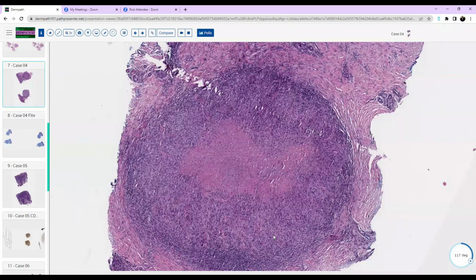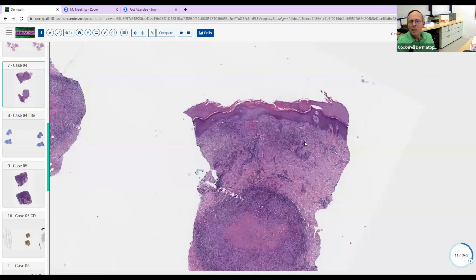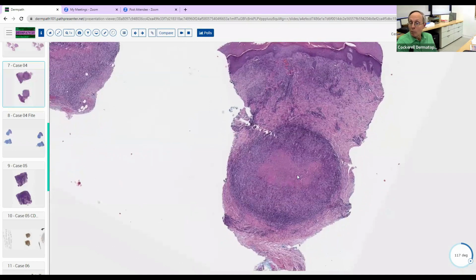Yeah, those are more of the foreign body granulomas, but there is acne, granulomatous rosacea can give you tuberculoid granulomatous inflammation. That's in the acne spectrum. So that actually can give you this, usually not this deep, large granulomatous inflammation like this, usually little smaller areas, but you'll see little granulomatous inflammation up here around follicles. And the differential diagnosis of granulomatous rosacea is sarcoid clinically, but if you see the caseation degeneration in the small tuberculoid granulomas, you should think that it may be granulomatous rosacea. And then, you're right. You should think about a foreign body here. And so you can polarize it. In this case, it happened to be negative.